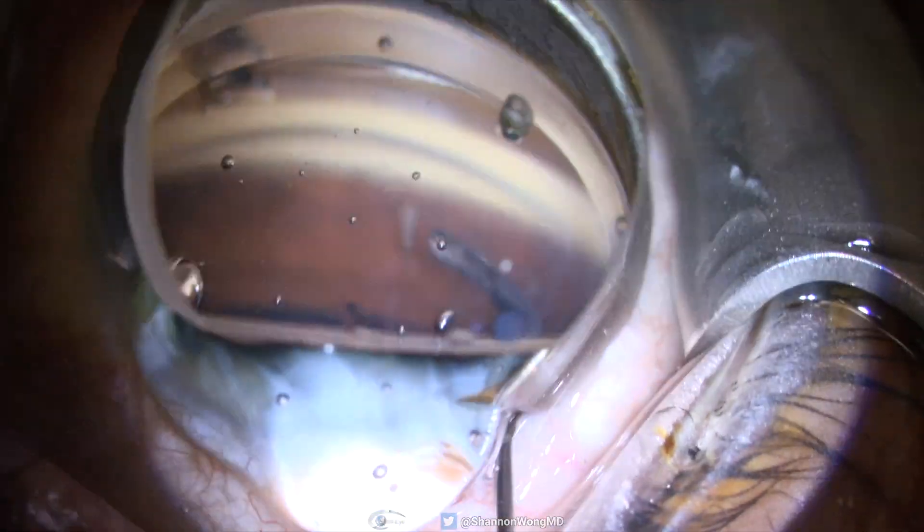Using the gonio mirror, we visualize the pigmented trabecular meshwork, then use the tip of the Hydrus inserter to pierce the TM. Then the Hydrus is inserted into Schlemm's canal.